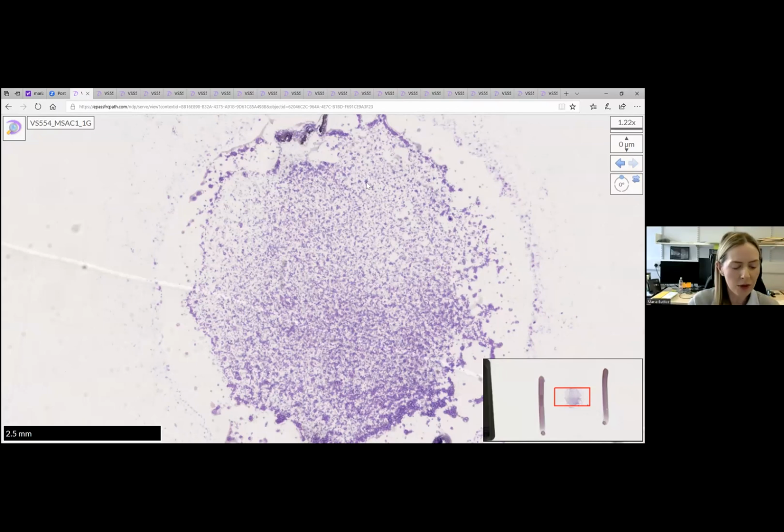Yes, thank you. So what I've done is I've selected good examples of our daily reporting in cytology, which also make good examples for the exam. So the first case is a 76-year-old male with a unilateral effusion, and these are cytospins of pleural fluids. So please go ahead and put in the chat box what your diagnosis is and any thoughts on it. So I'm going to start at low power and I'll go on to higher magnification so that you can assess the cytomorphology.